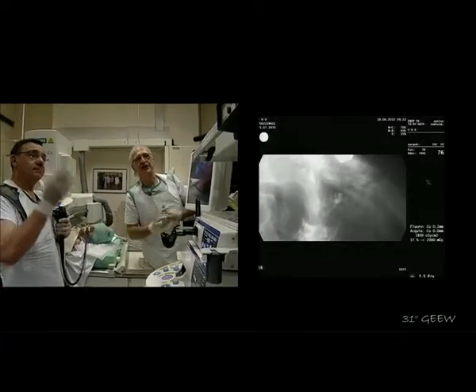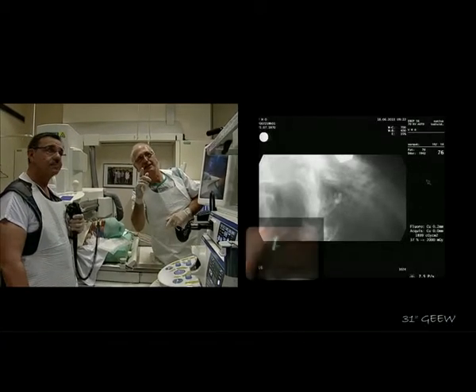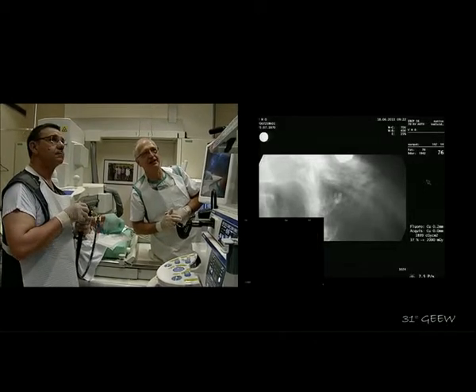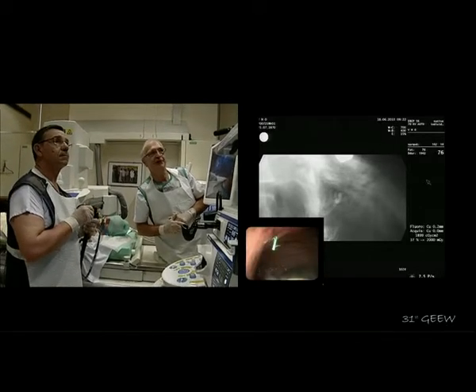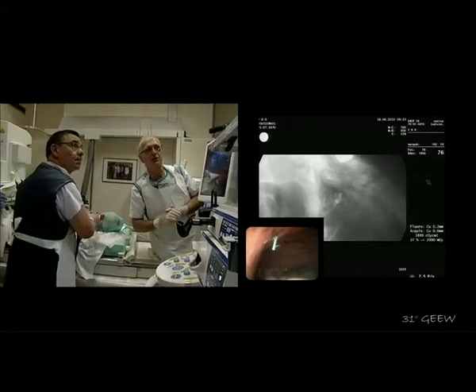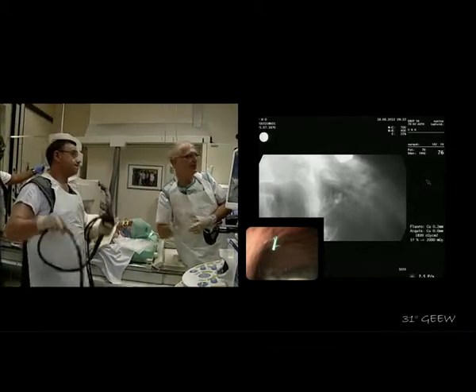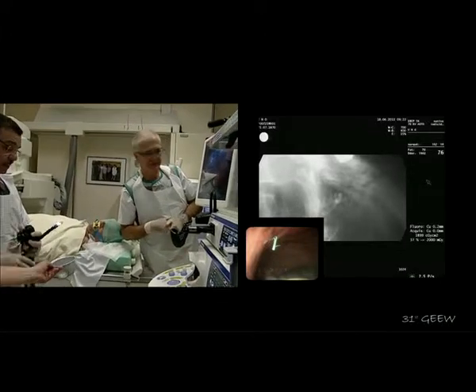So we have to congratulate Mark, Sonia, and all the team because they have been able to finally place the stent. You see that you should have the fluoroscopic and the endoscopic picture. You see that we have placed a 5 French 7 centimeter stent into the pancreatic duct, and you see the nice loop at the entrance of the duct, but the distal flap is inside the duct, so the risk of migration is low. Just to conclude, the next step in this patient will be to recolocate the patient in 1 month, to opacify the tract after removal of the stent, and to place a larger stent which will stay in place for months or years. Oh, excellent, and congratulations.